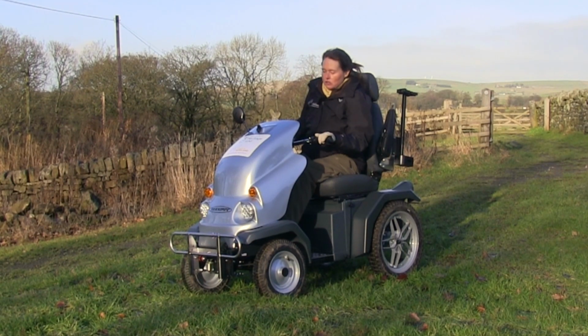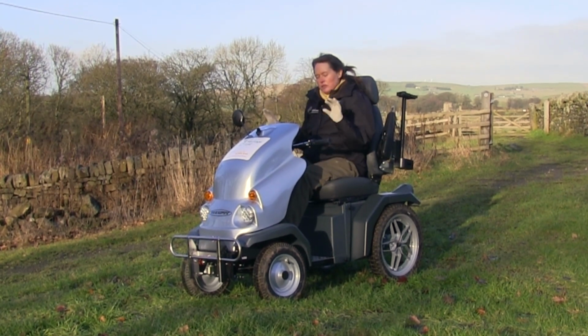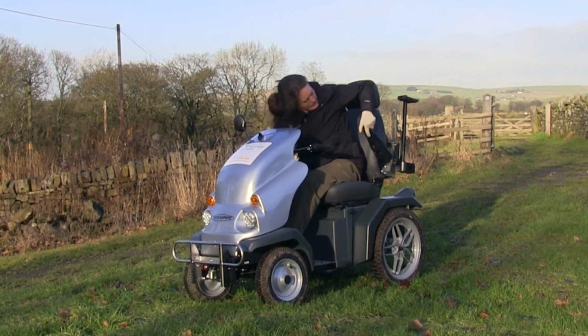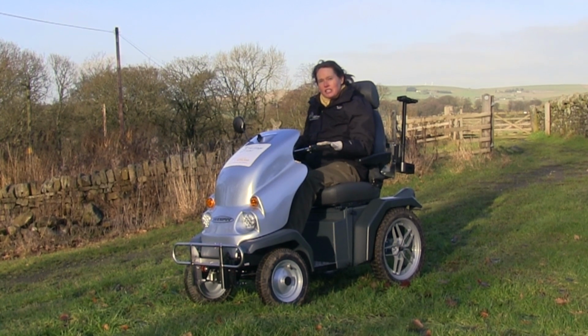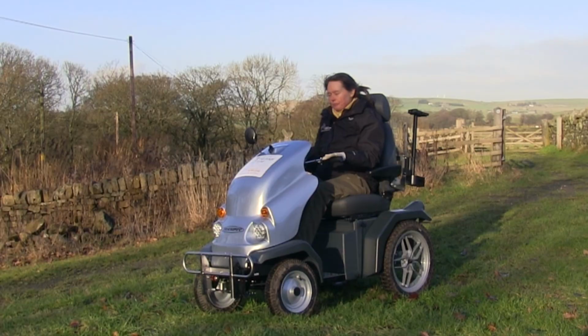So once you've got your feet flat on the plate in front of you and you've got your hands comfortably on the handlebars with the armrests down and adjusted in the right place so that you can sit really nice and comfortably, we can look at the controls.